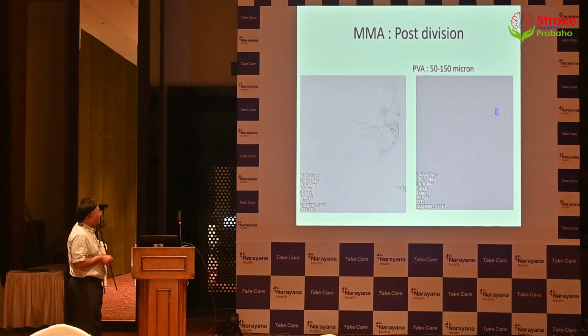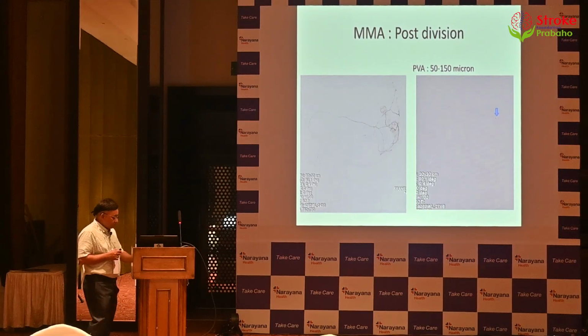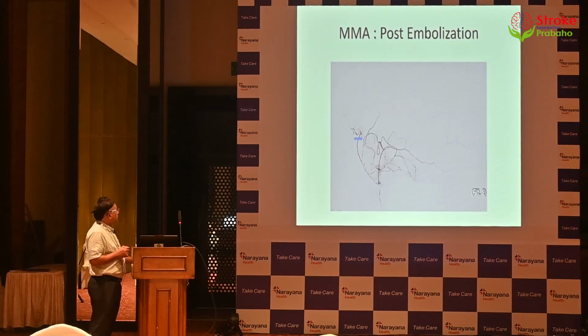We went more distally. This is the ultimate microcatheter position to place the PVA particles. 50 to 150 micron particles are placed. This is the post embolization.